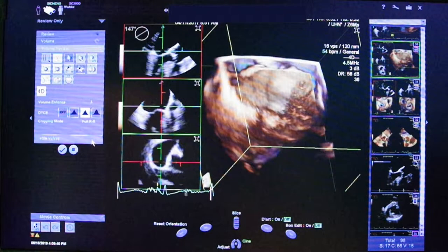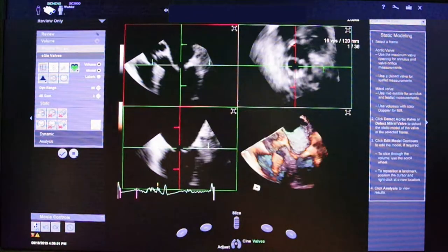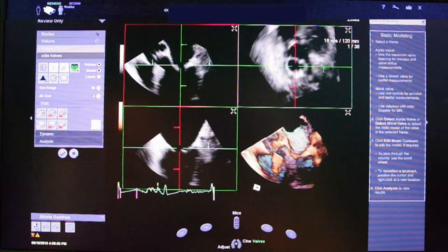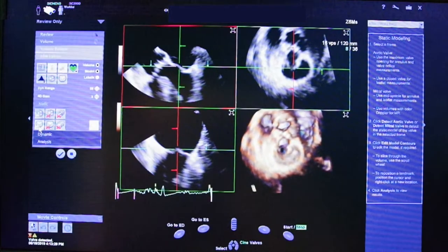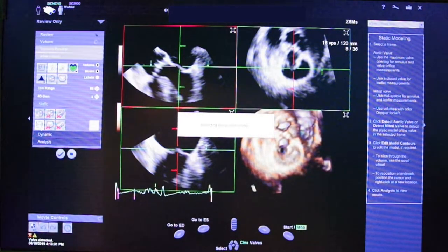Let's start by selecting a 3D clip and launching EasyValve. As you can see from the top left panel, the MVE is open. By clicking on this button on your echo machine, the frame will be shifted to systole. Now, by clicking on Place a Static Mitral Valve, an automatic MV model will be generated.